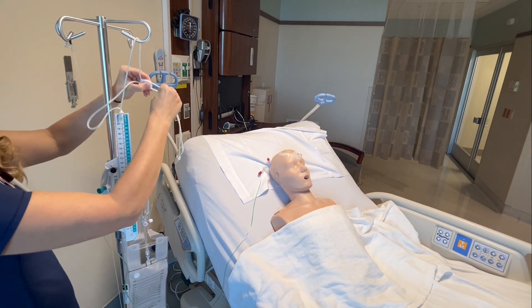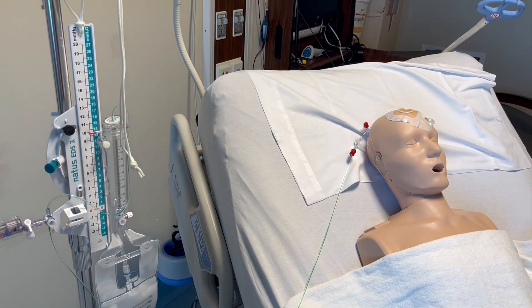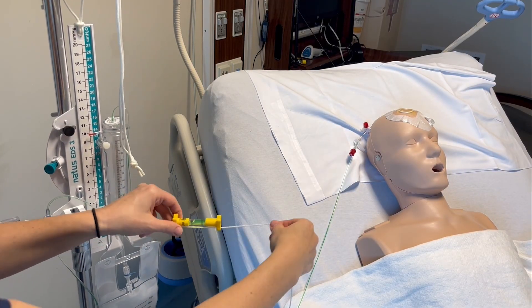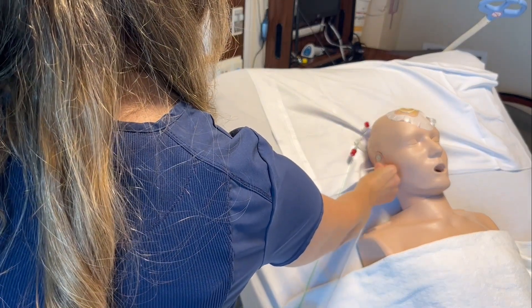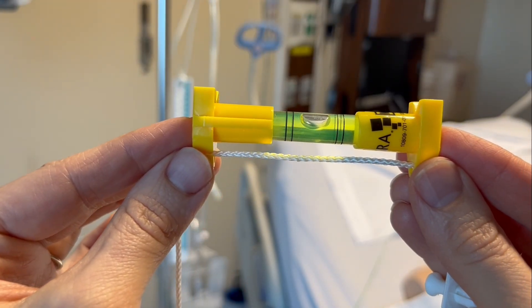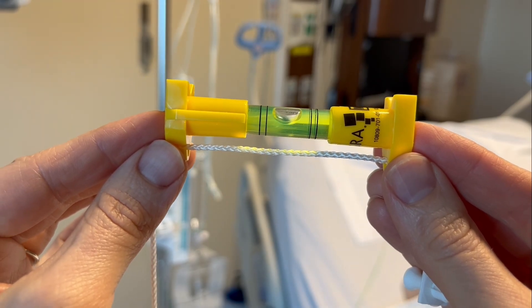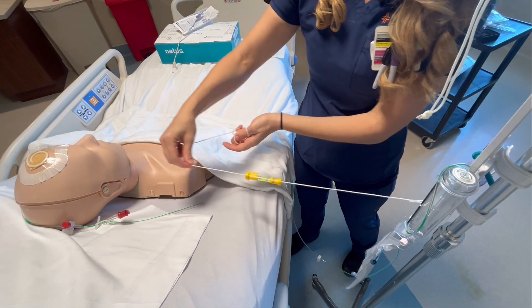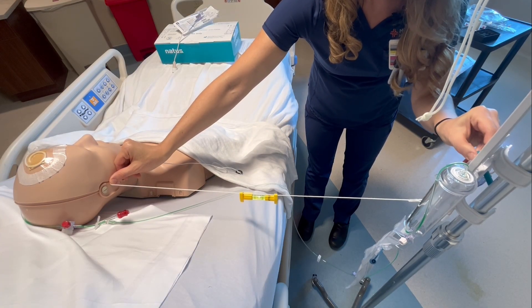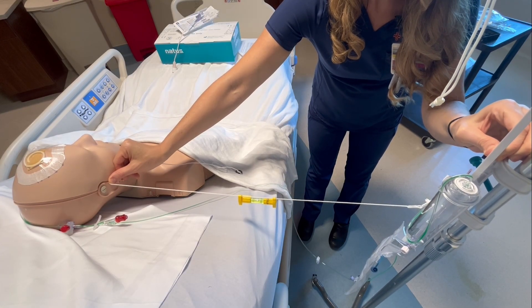Once the EVD is inserted, the next step will be to level the drainage system to the patient. Attach the leveler to the drainage system — there are many different types of levelers. You can use a string leveler, a ruler-type leveler, or a laser light leveler. All of them use a bubble vial, and your goal is to get the bubble in the middle of the two lines. Once the bubble is in the appropriate place, measure from the zero pressure reference point to the external auditory canal of the patient's ear, and adjust the EVD as needed to level to the external auditory canal.